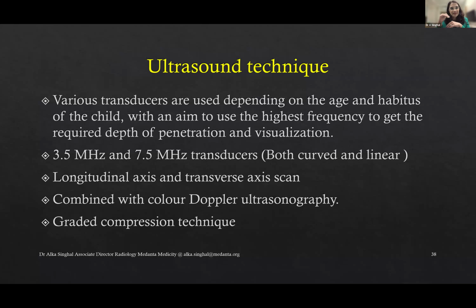What it is, basically, you just move your probe gently to displace the air so we can actually evaluate the bowel very well. Now, why is that important? Because the bowel air will not let you see. You may be able to see the anterior bowel wall, but if you displace the air, then you can see the posterior bowel wall as well.